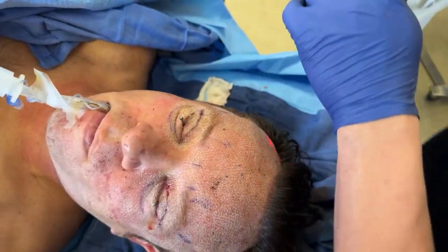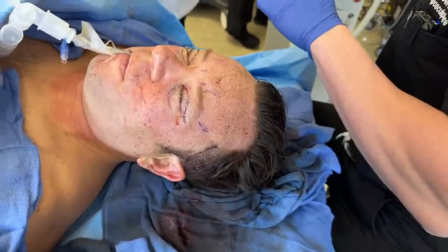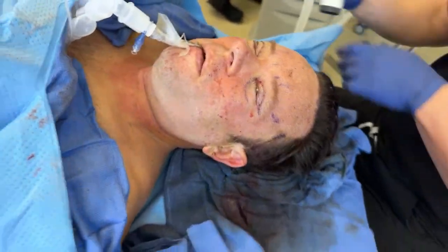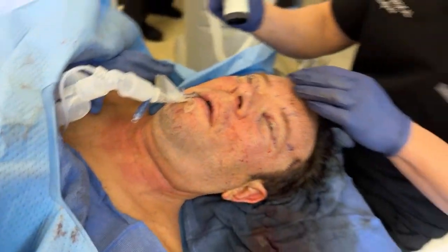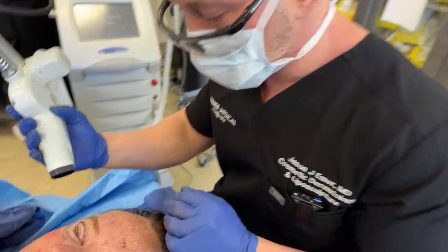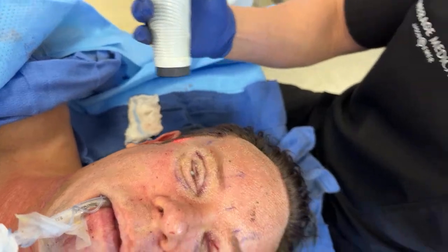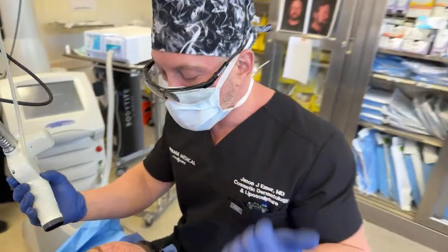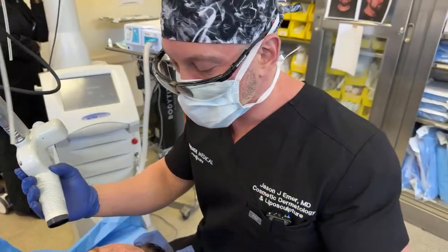Okay, so that's our eyes. We're going to continue on to the rest of the face. We're going to do the neck. It's very important to not neglect the neck. That area does get a lot of sun exposure. Exactly. So now we're going to continue with the rest of the face and continue our rejuvenation treatment. So that's our periocular rejuvenation, you guys. Combination of plastic surgery plus cosmetic laser. I think that's the best combination.